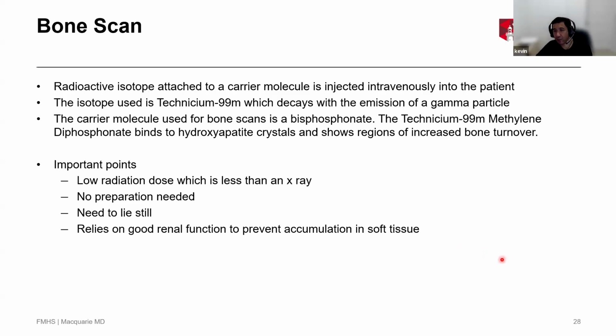So if we go back and look at imaging using X-ray and CT, that is an external radiation source. We are shining X-ray beams onto the patient, whether that's in a CT scan or an X-ray, and we're looking at the shadow and reconstructing the shadow. With ultrasound, we are putting sound waves into the body and seeing what comes back and using that to reconstruct the image. With MRI, we're lining up all the protons in a strong magnetic field and putting a radio frequency pulse into the body and waiting and listening to what comes back, reconstructing that echo and creating an image, okay? Nuclear medicine is now different.